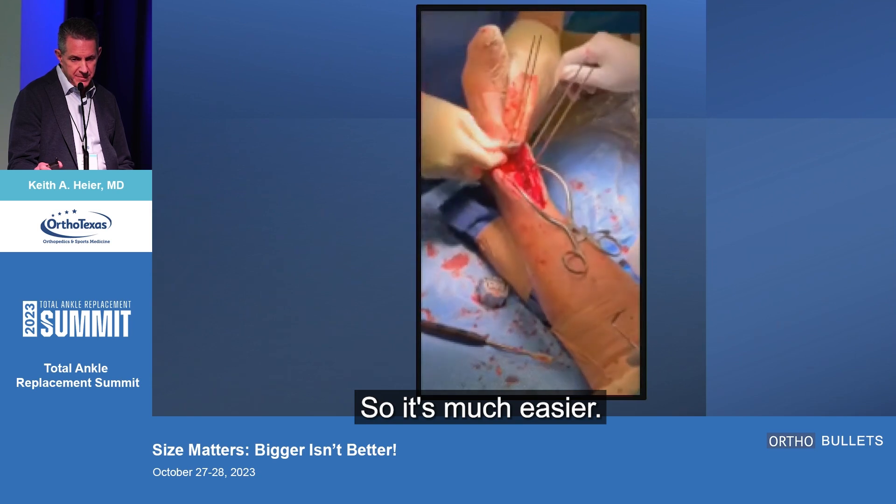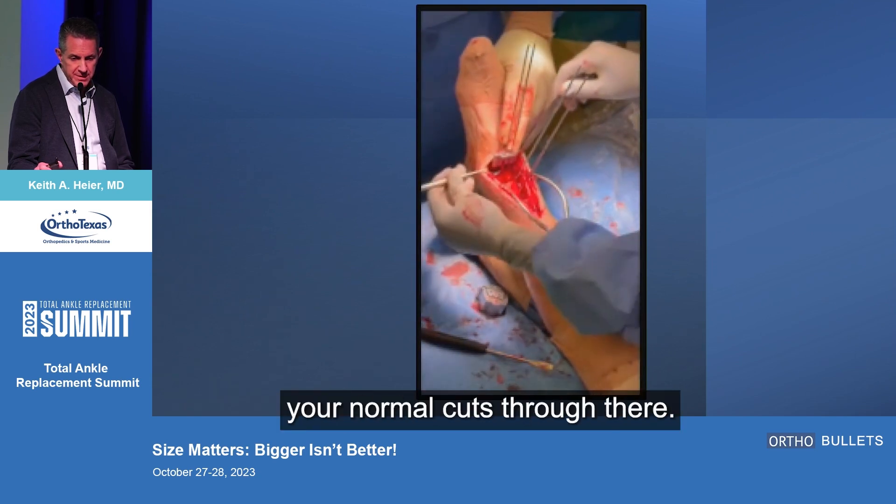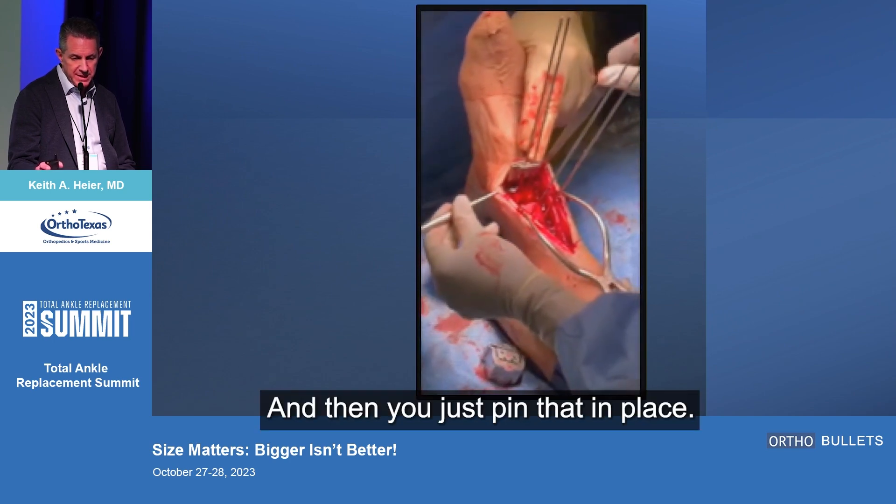It fits much easier, and then you just do your normal cuts through there. I do a flat top cut anyway, and then you just pin that in place.